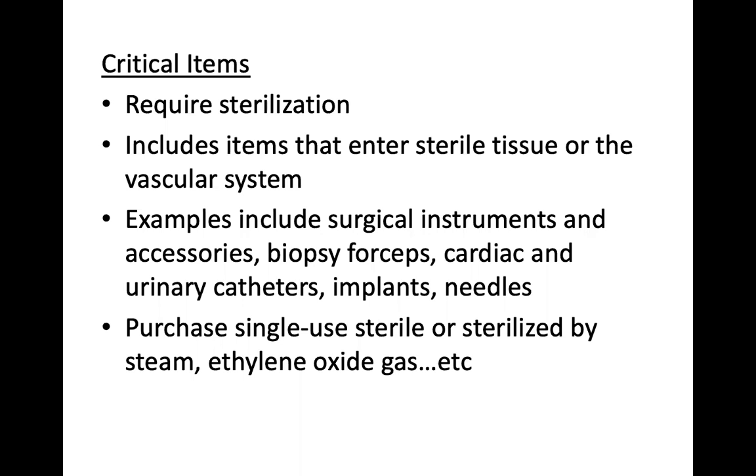Think of surgical instruments or equipment or accessories that you use to take a tissue biopsy. So you're carrying out an investigation for cancer. You need to take a tissue biopsy from the breast, for example. So inside the breast tissue, you do not have normal flora, okay? So if you're going to use a surgical blade, forceps, or any other item or device that is contaminated, it means you're going to introduce microorganisms into a place that is normally sterile, okay? And that is wrong. That is going to be the beginning of another problem. So any item or process that is classified as critical requires you to observe sterilization.